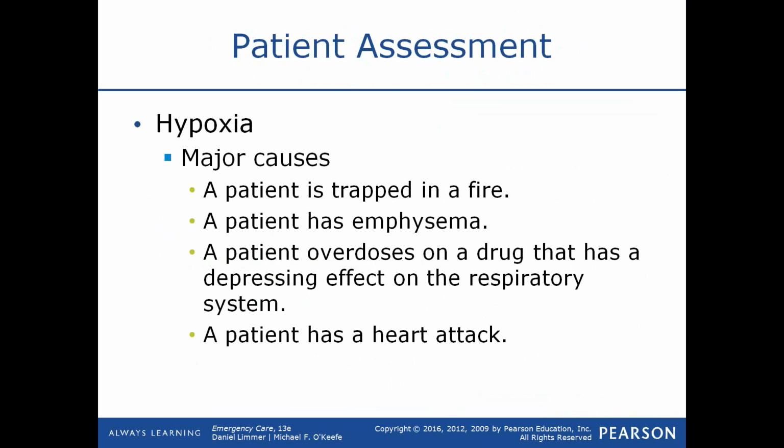And the only thing a pulse oximetry tells you is what percent of the red cells that you have are saturated with a gas. It doesn't tell you how many red cells you have, and it doesn't tell you what the gas is either.